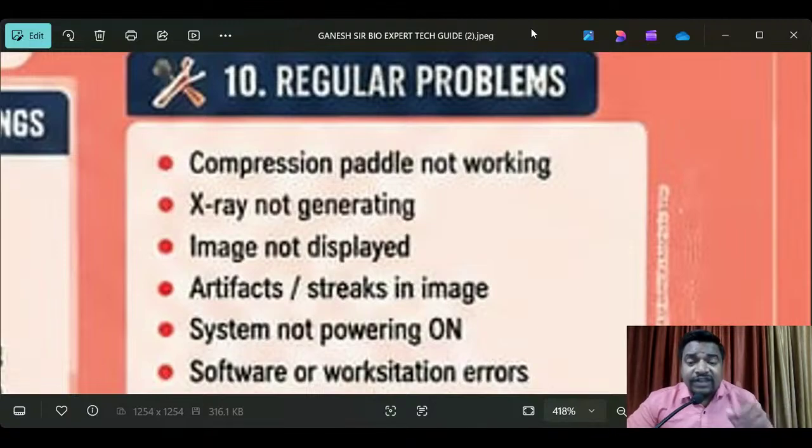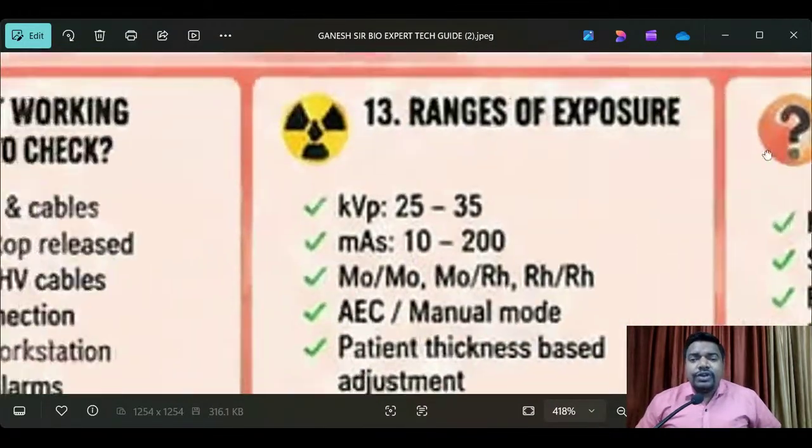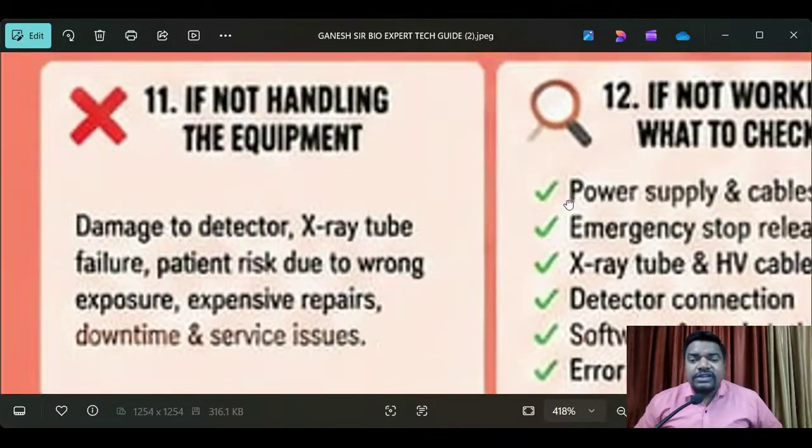And a daily logbook is very, very important. Understand? Because nobody is perfect. Not within seconds, not within 1 day, 2 days, 3 days. Today I'm coming here with 18 years of experience in my life. Today I'm giving this, it's a time-taking process, not a simple statement. Okay, I hope you got it very clear. Yes. Next point. Every point, pin-point, I'm going to show you, because only valid, required, essential points I'm going to discuss here.